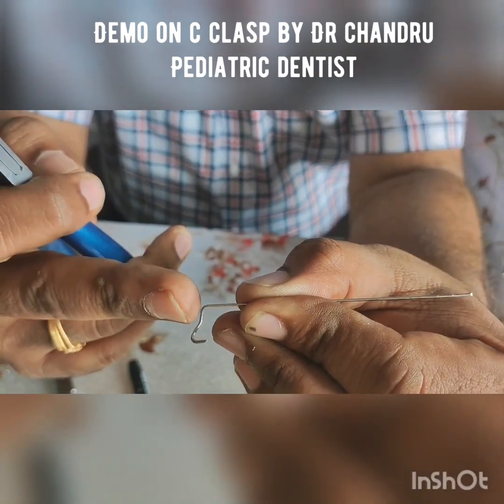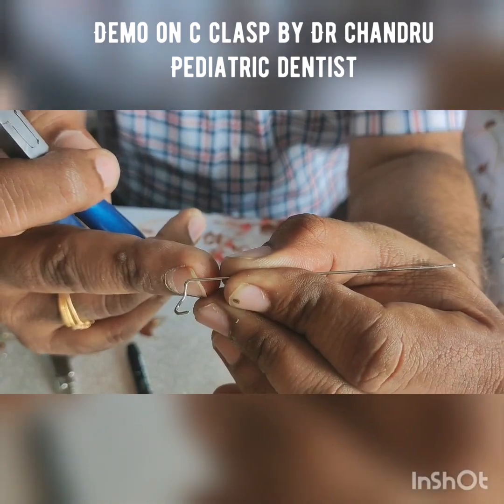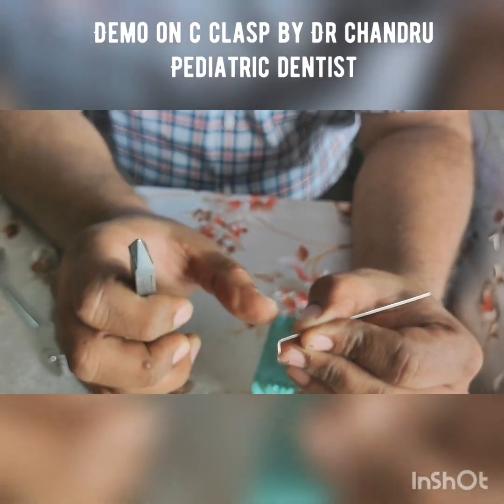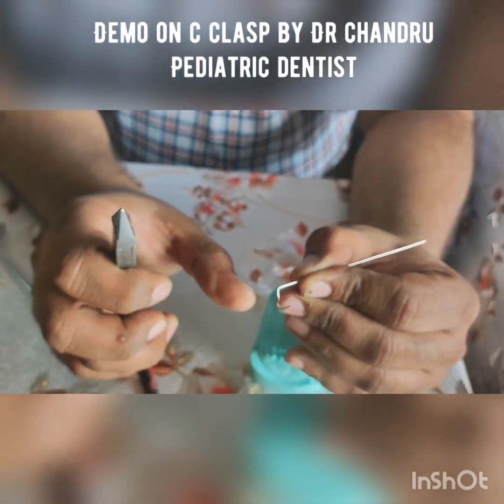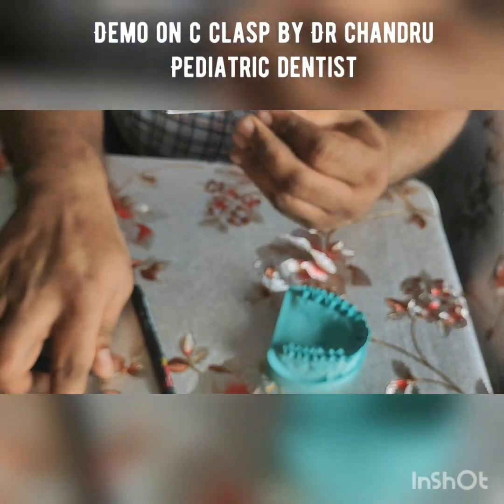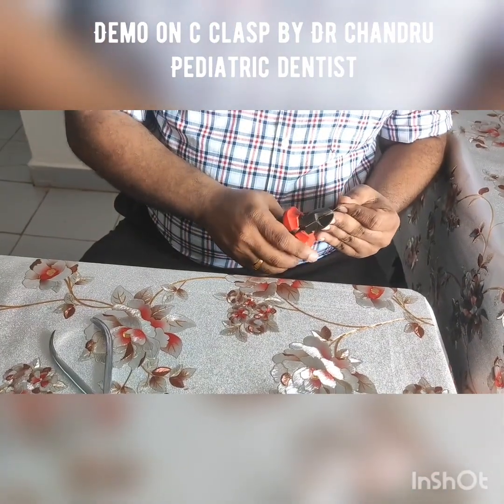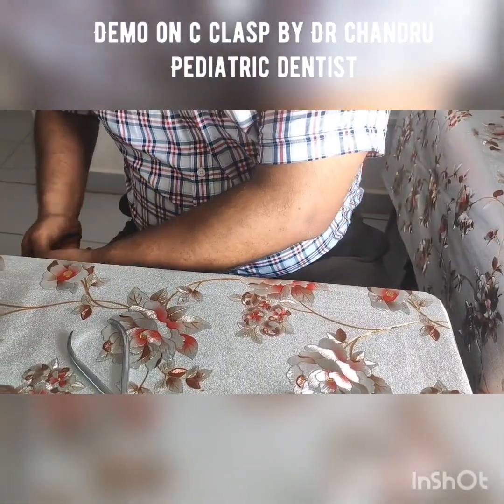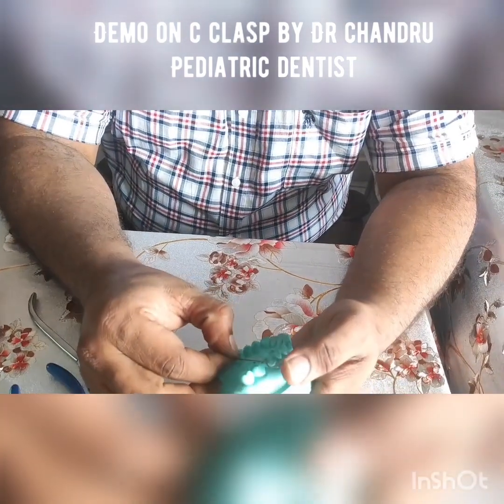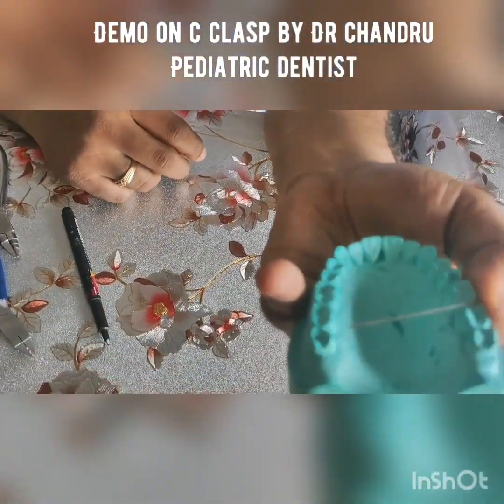Second thing is the reverse bend. The third step is to give a 90-degree bend, and this 90-degree bend will engage the occlusal embrasure or the occlusal surface of the tooth. So since this wire component has an excess of wire, now we'll cut the excess of wire and the required quantity of wire will be kept and checked for the bend whether it has been given correctly or not.